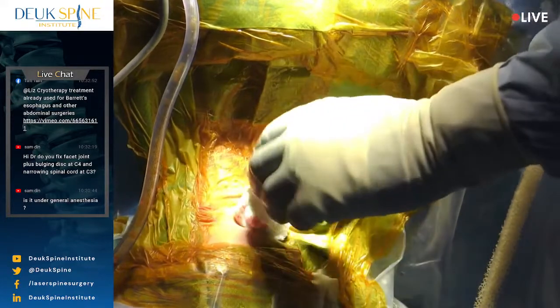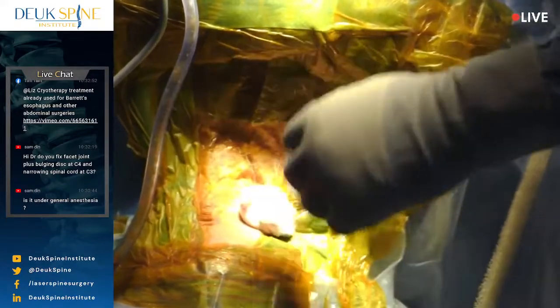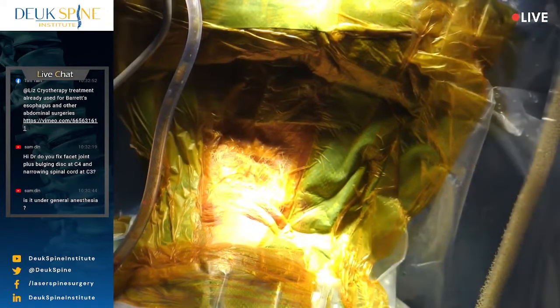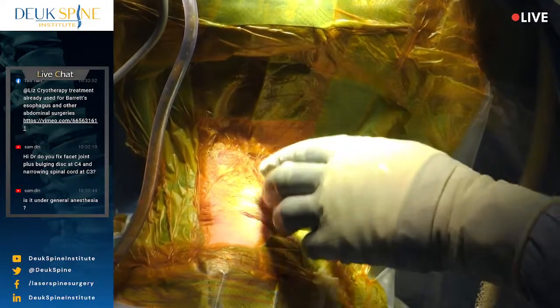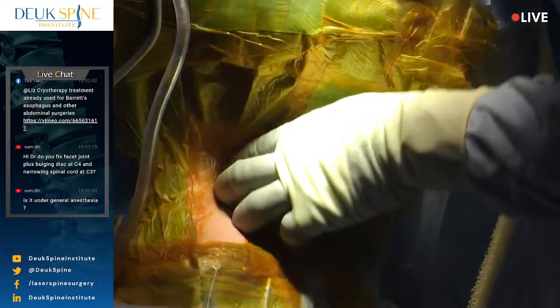Are we ready? Just make sure he's not gagging, he's not coughing, he's supple, I think. You've done a very good job, doctor. Let's get started. Make sure I don't have too many wrinkles. Otherwise, they can catch on the needle and you have a bad day. I can feel the collarbone here. There we go.